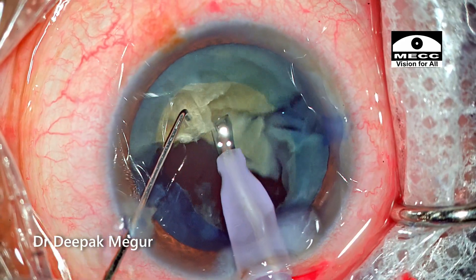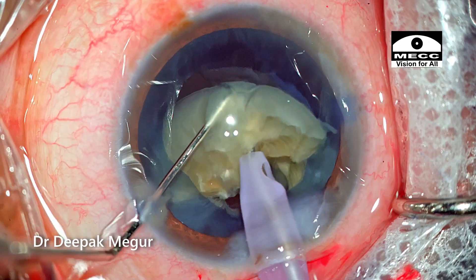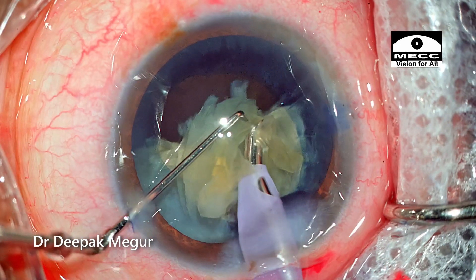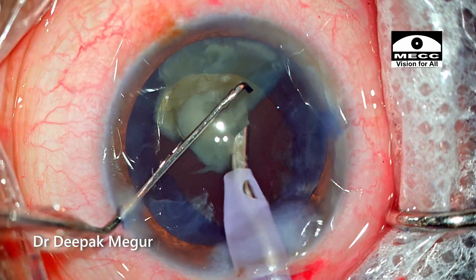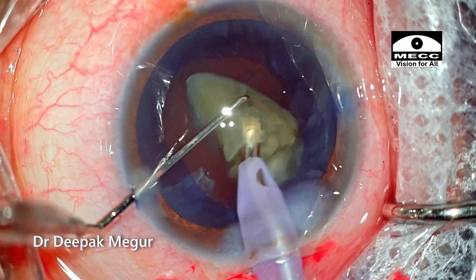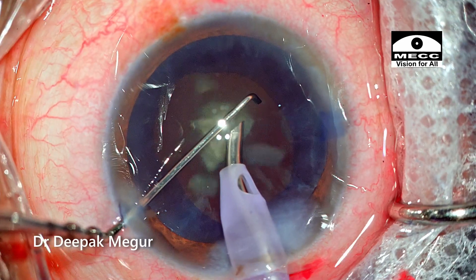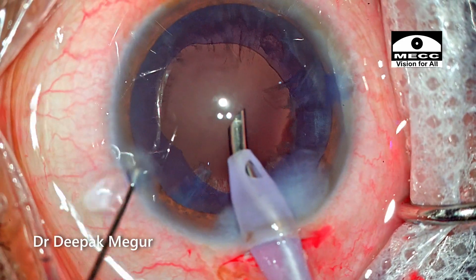The remaining hemi-nucleus is then cut into many small fragments and aspirated. This fragment shows a little bit of turbulence but is consumed, now moving on to the last fragment. Please note the position of the chopper — it is kept in such a way that it acts like a barrier and prevents the fragments from flying out. One fragment does fly out and gets stuck in the side port, which is then released and aspirated.